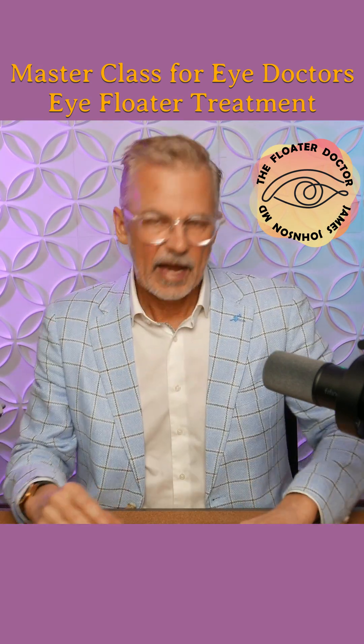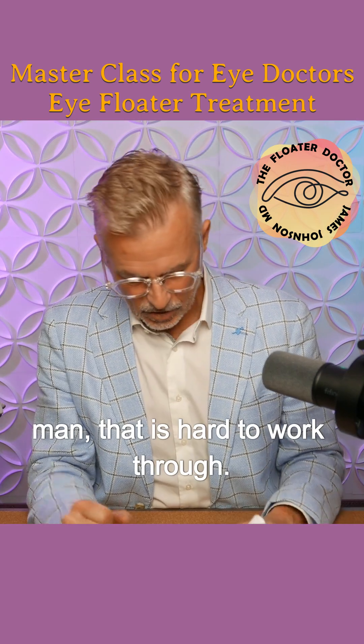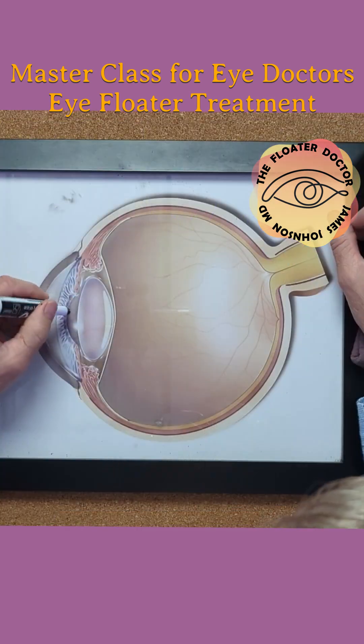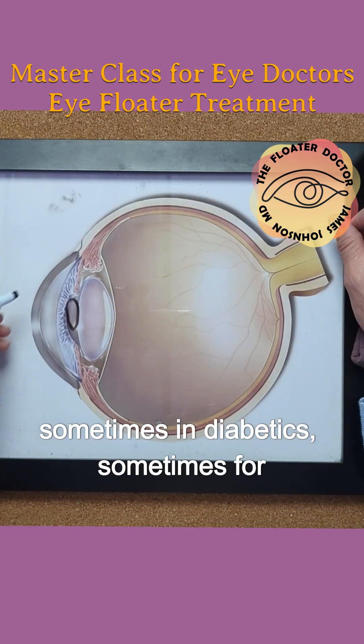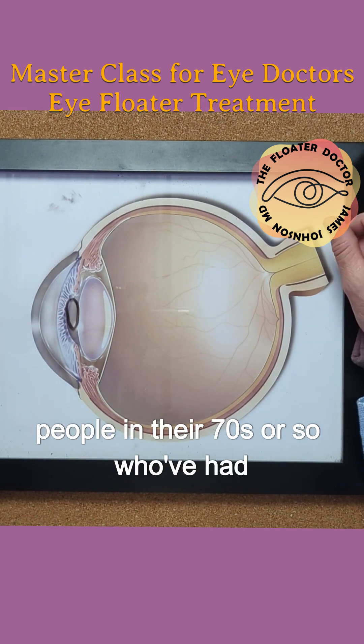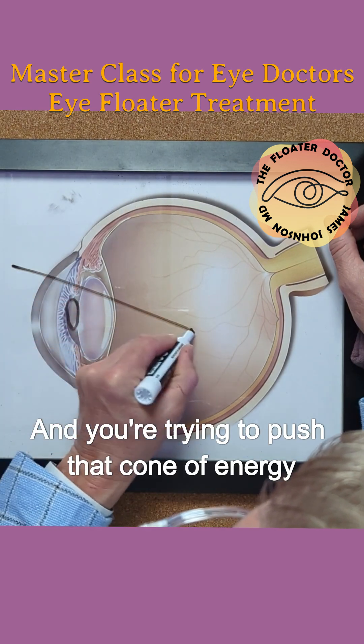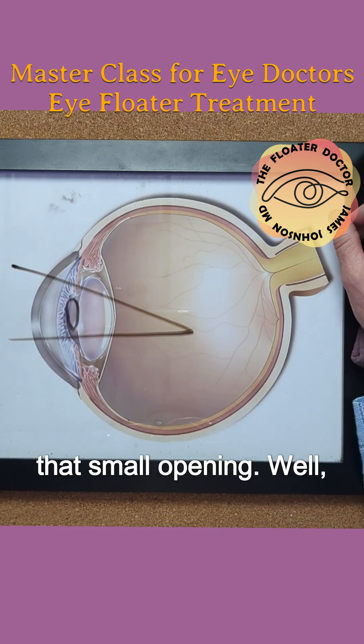You just have a nice big area to work through. That small pupil is hard to work through. A small pupil — and this sometimes in diabetics, sometimes for whatever reason, people who've had cataract surgery, older people in their 70s or so who've had cataract surgery — sometimes that pupil just won't open. And you're trying to push that cone of energy through that small opening.